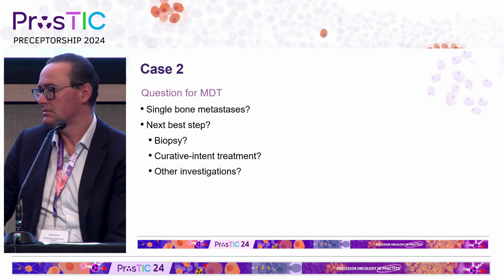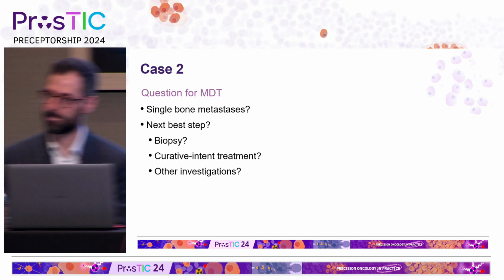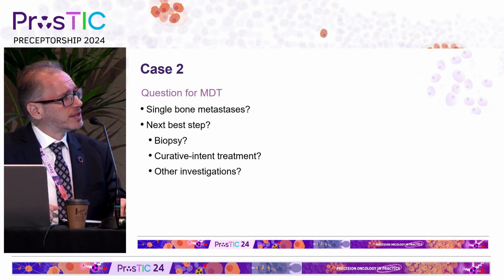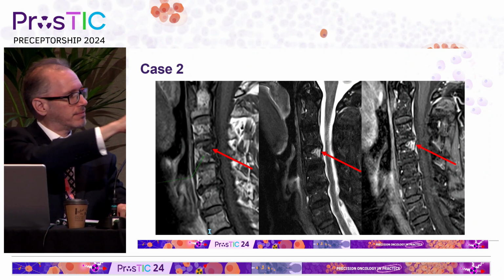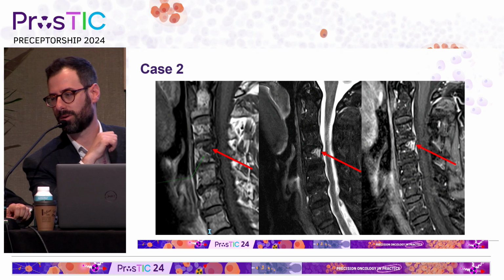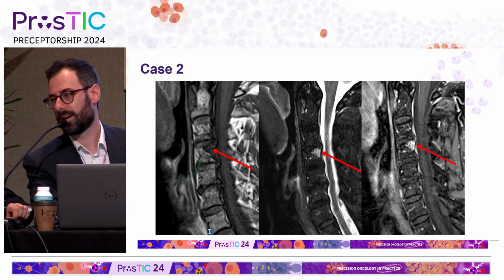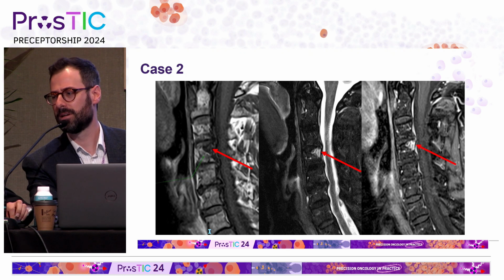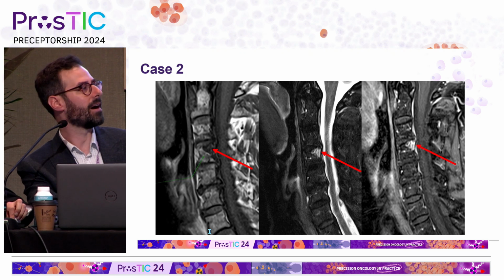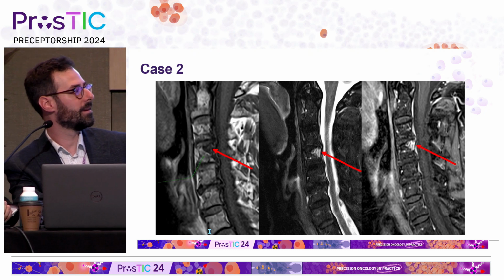Yeah. So I think at this MDT we elected to do an MRI since there wasn't really a definitive finding on the CT. I think hemangioma was suspected based on some very subtle findings on the CT. So an MRI was done. You can see clearly, I mean, this is MR 101, but to the left you see it's hypointense on T1. You have a little bit of hyperintensity in the middle on T2, and then it does enhance on contrast. So it doesn't seem to be very high fat containing. I don't know if you have any thoughts, Sid? So that's not diagnostic of hemangioma on the images that you've shown. Yeah. So that creates some more doubt.